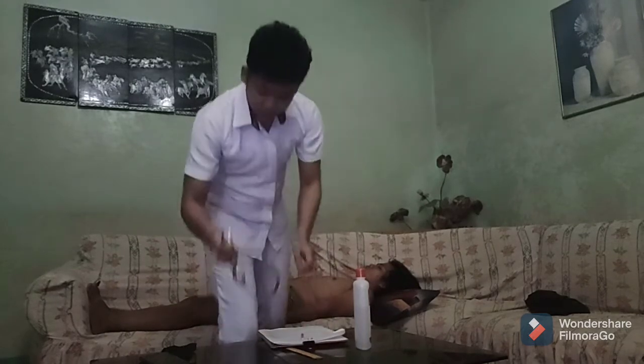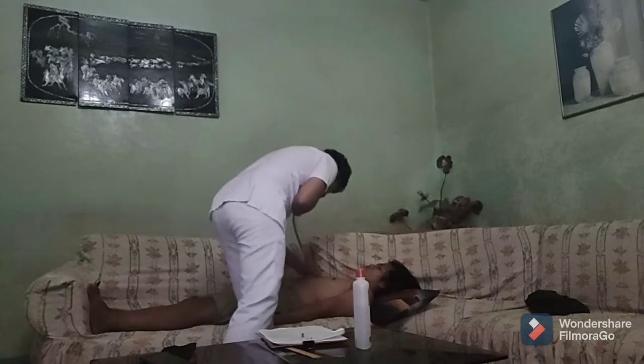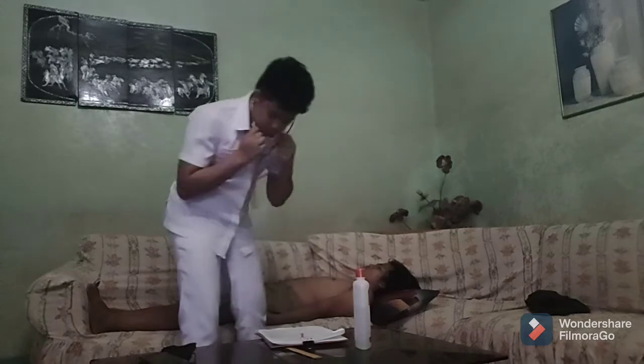Then, next is to auscultate heart rate and rhythm. Place the diaphragm of the stethoscope at the apex and listen closely to the rate and rhythm of the apical impulse. The diaphragm of the stethoscope is best for detecting high-pitched sounds. Sir, I am going to auscultate you. Okay, sir.